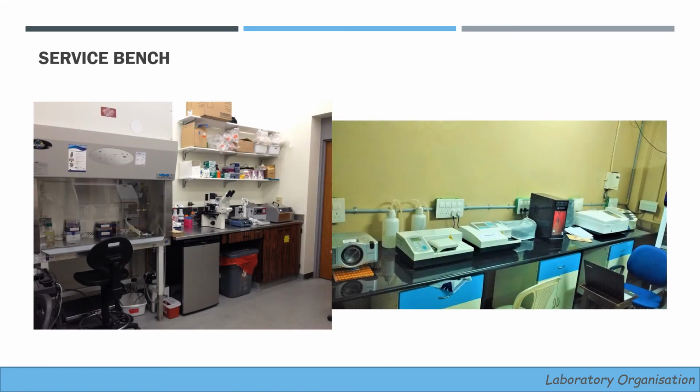The service bench, ideally fitted with drawers and open shelves above, should be provided for the storage of sterile glassware, plastics, pipettes, screw caps, syringes, etc. The bench is also convenient for placing a microscope, cell counter, small centrifuge, etc. near the sterile handling area.